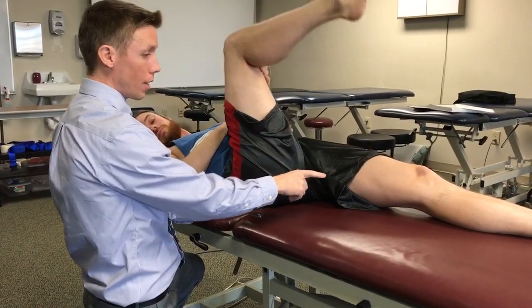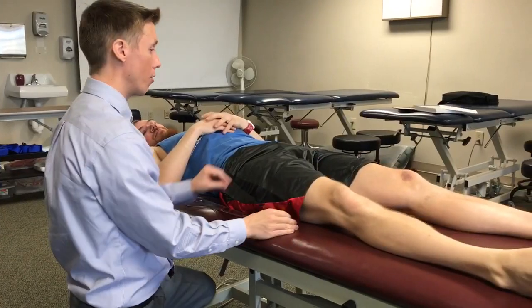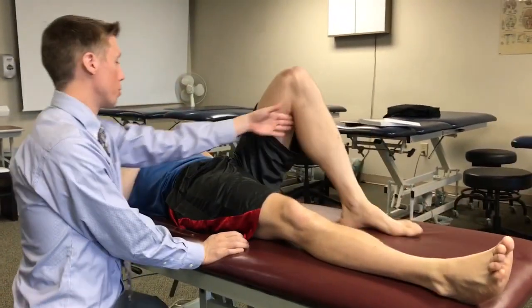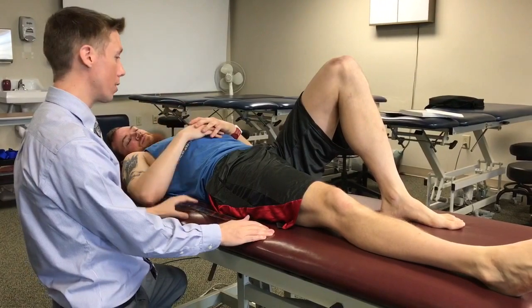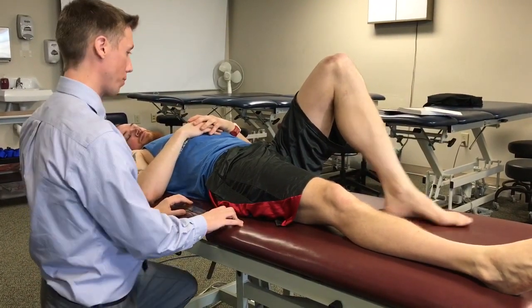Make sure that the other leg is straight. If the other hip is bent, that will cause — or is more likely to cause — the innominate to posteriorly rotate.